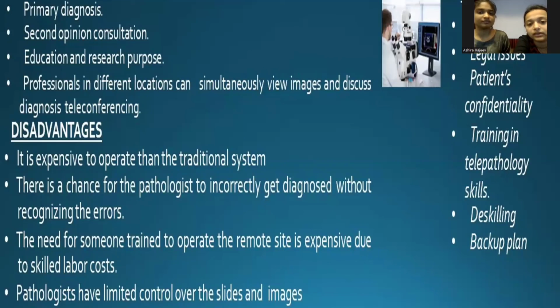Although at present, the system is not capable of replacing an on-site pathologist, the results were encouraging and suggest that the remote control, remote diagnosis has the potential to increase the efficiency of pathologists. This method has potential to improve several aspects of pathological practice for the better benefit of patients' care, hoping a better future in the technique of robotic telepathology.